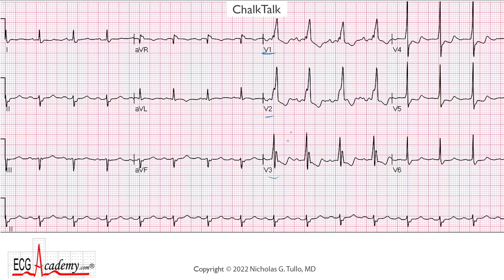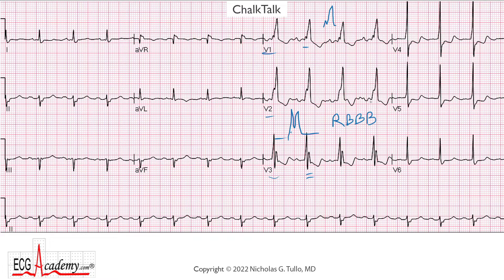That is here in V1, V2, V3 — you've got this very large upright deflection, and you have an RSR' pattern. Look how nice that is in V3. Here in V1, it's sort of a little R, and then the R' kind of goes high. Same thing in V2. So this is consistent with a right bundle branch block, and you can identify this as being one of the major problems with this cardiogram.